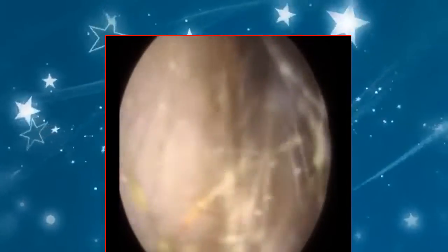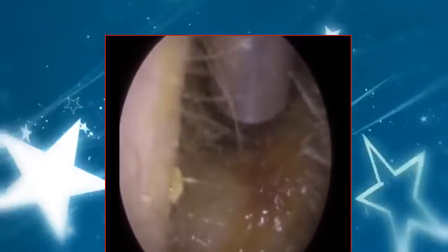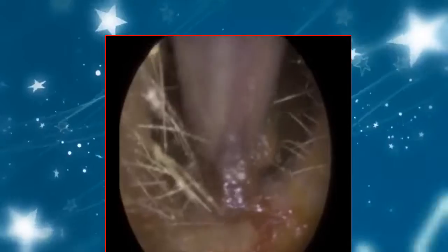The right ear itself was very straightforward actually. The wax wasn't fully occluding or fully impacted. You probably saw there a bit of remaining dead skin coating the ear canal. I decided to leave that. That skin is not going to cause the patient an issue. Sometimes less is more. When you've got a very nervous client, you don't want to prolong the procedure any more than is required, and that skin is not going to cause, as I said, any symptoms to the patient. It's best to leave that alone.